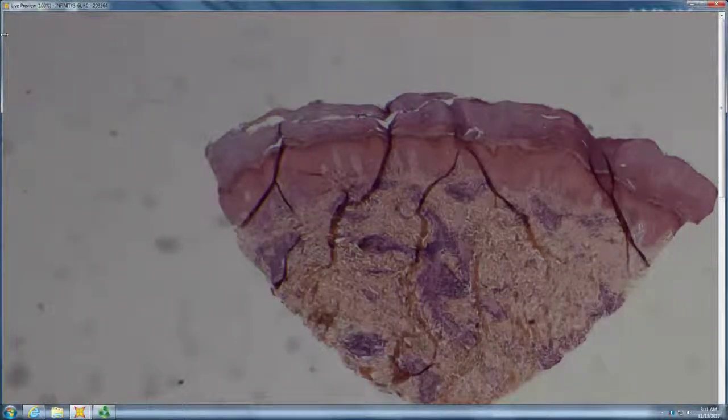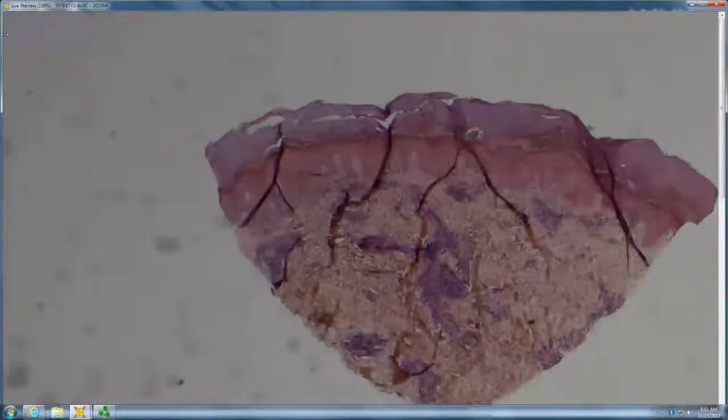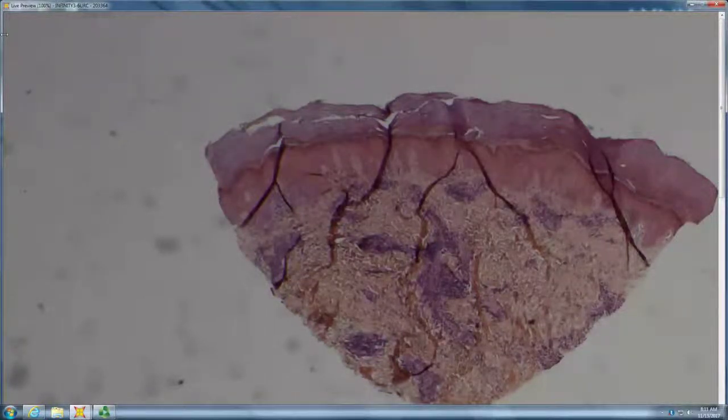You also have a little bit of spongiosis, tagging, and papillodermal fibrosis. So what's your differential? Like PPD, like MF? Yeah, that would be your rule out. This is either PPD or this is MF that looks a lot like PPD. That's your differential. Then you've got to go through an MF workup and also take a look at the patient, because that'll usually help.